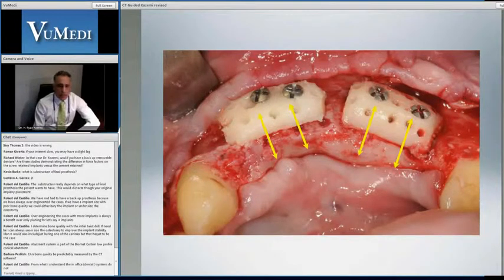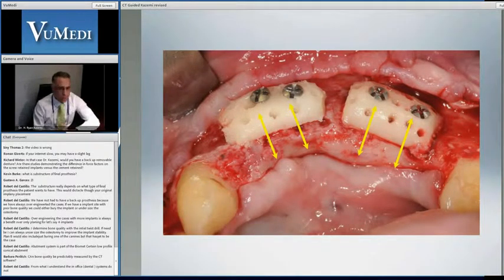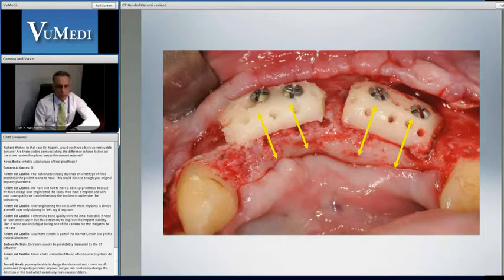And now we can really see how the implant foundation or the site is being developed, where we can ideally position the implant guided by where the restoration is going to be, and we will have good stabilization as well as coverage.